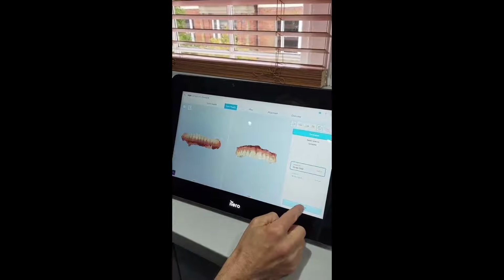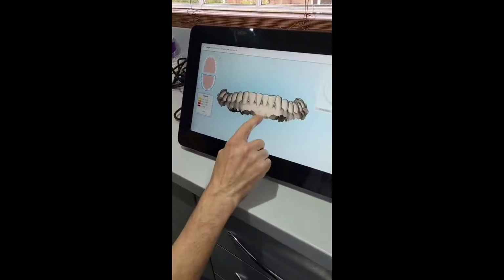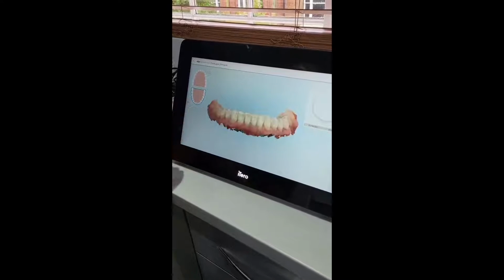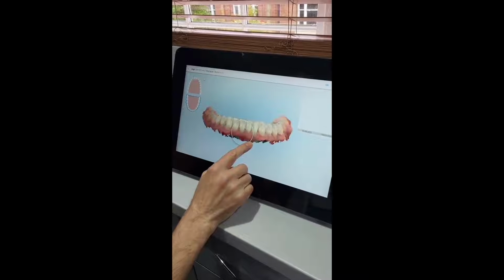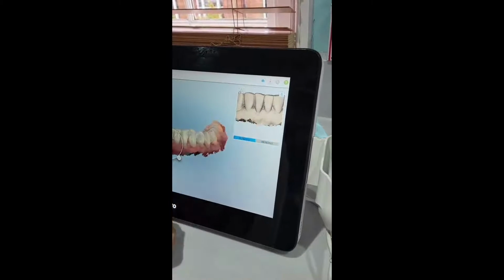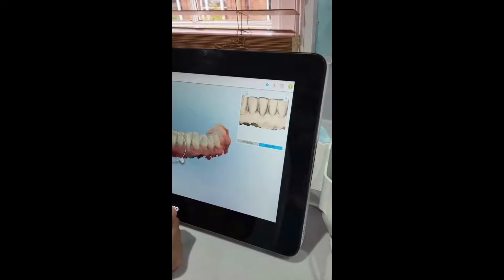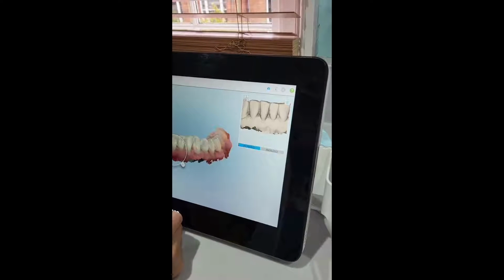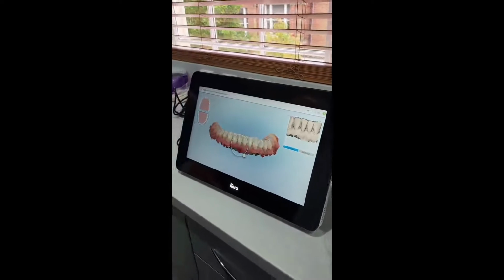The scan must be on the same Itero, and so we're looking at this area here, and I'll put the real life view on, and it's that bit there. So you'll see this changes. It's automatically going between the two scans. These are just 3 months apart, and we did a little bit of refinement for Donna in the meantime. So no difference there, but a great way of monitoring gum health.